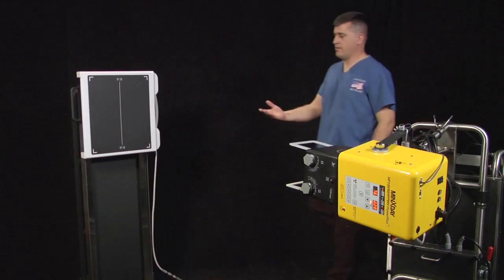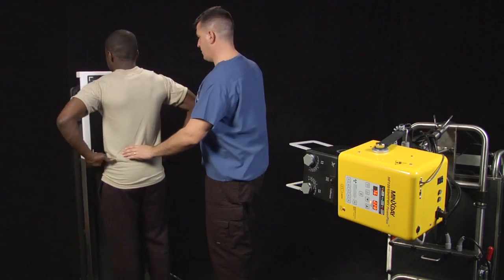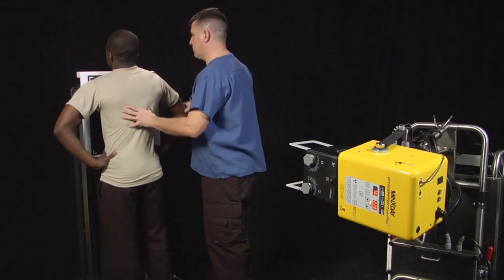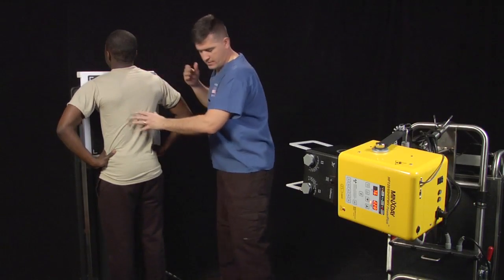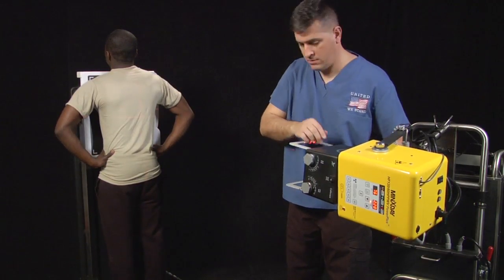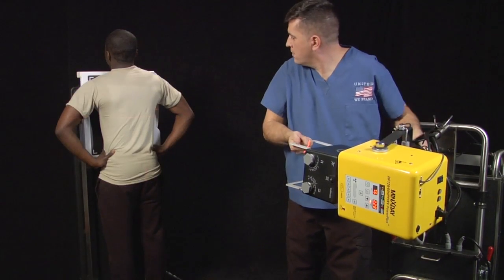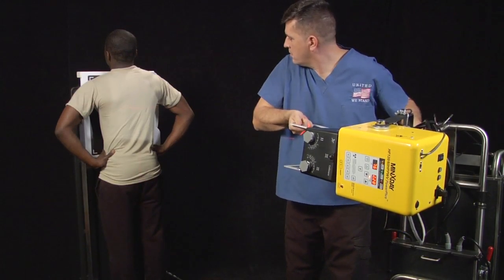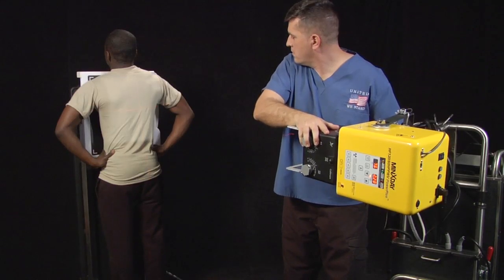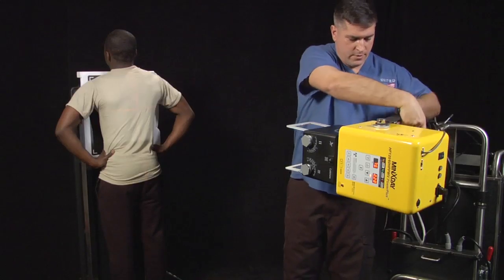Position the patient with chin raised, hands on their hips, and elbows and shoulders rotated forward toward the upright cassette holder. Turn on the collimator light using the button on the center of the collimator. Center the crosshairs of the collimator light on the spine with the top of the border of the light 2 inches above the shoulders.